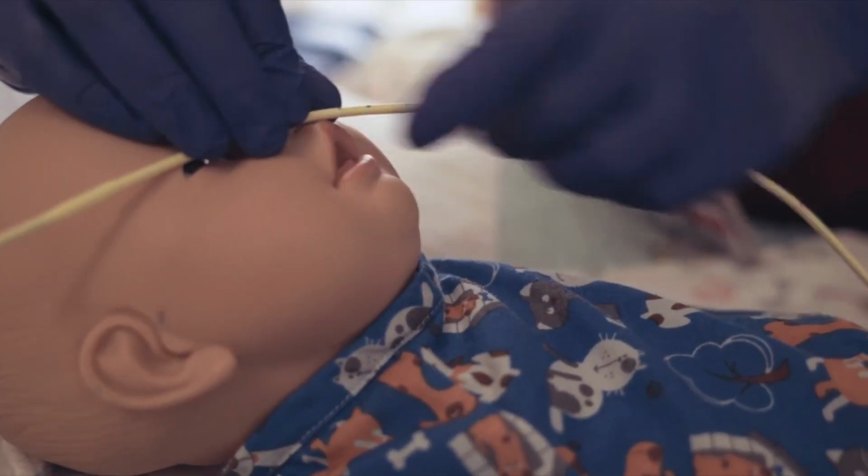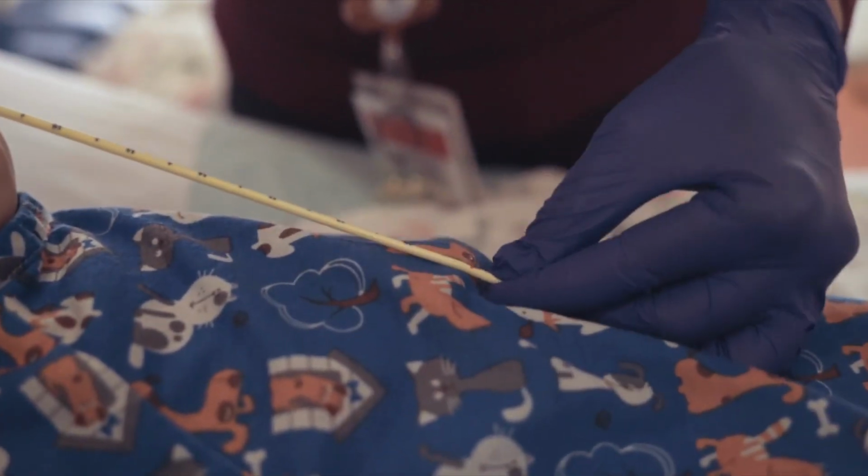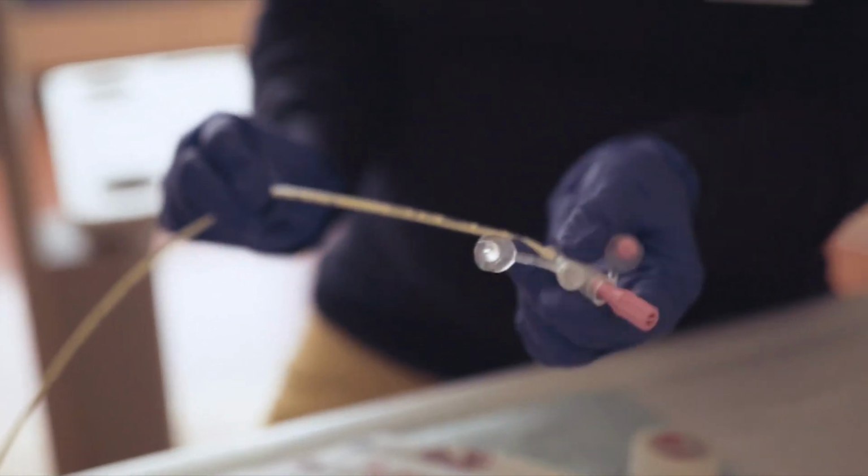The nurse went to put in a feeding tube and put it in through his nose, and she started to struggle. And they told us, from what we could tell, it looks like the feeding tube that your son had went through his trachea and went into his lungs. Through our study, we've discovered there are probably at least 25% of children that are at risk of a misplaced feeding tube, and something needs to be done about it.